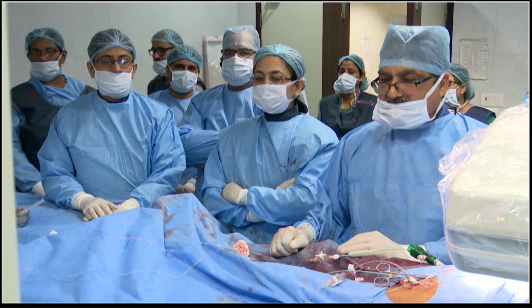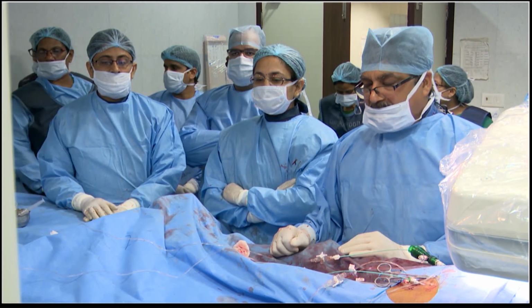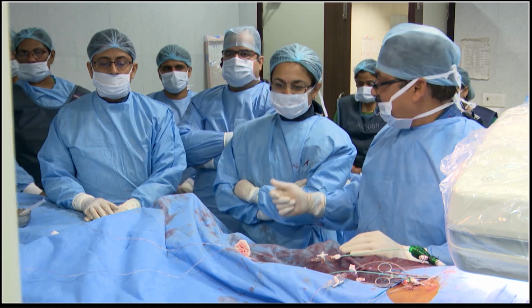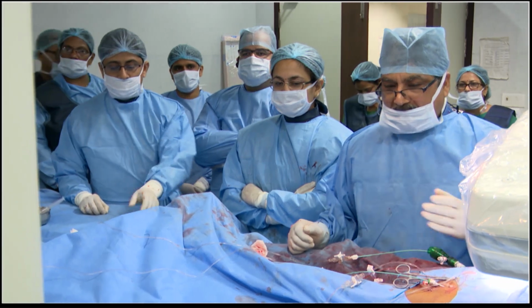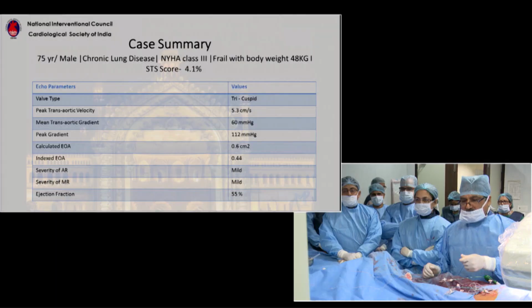It is a TAVI case that I have planned, and with me is my team. Dr. Rupali is there, Dr. Manik is there, Ankit is there. We have done some things, and I'll show you the case. Can we see the case?